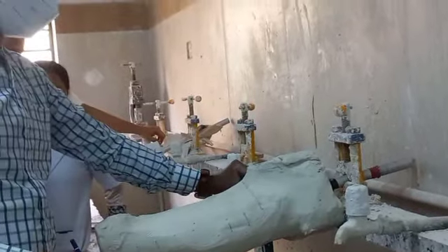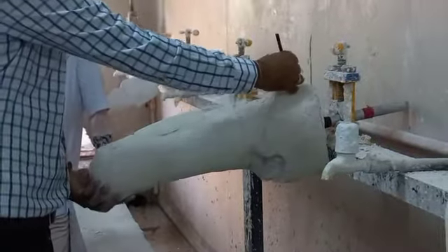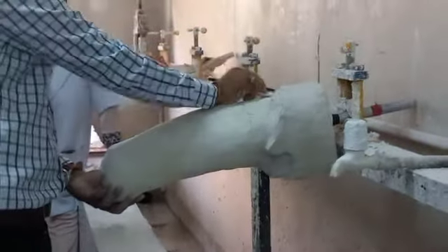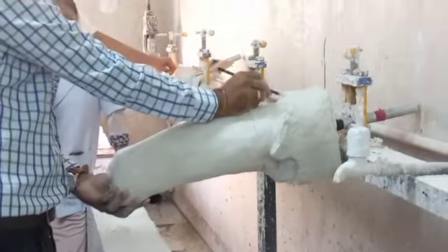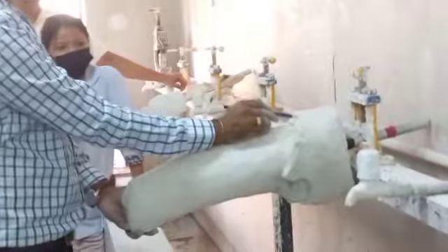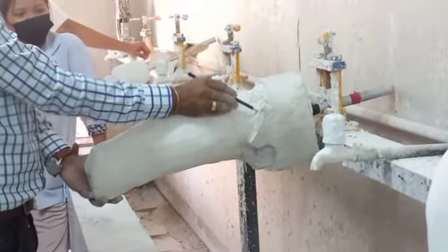So on the lateral side we are covering almost 10 centimeters, and then going anteriorly, where is the anterior border? Where the ASIS is. So let's say our ASIS is wherever it was, from there we will go 4 centimeters down and put a point. That point is where the anterior wall starts, and then it will be flattened. See, it's going down here, then it's flat. The trim line is almost flatter, and then gradually it's going down towards the adductor tendon on the medial side.